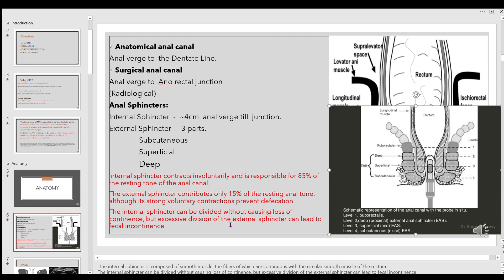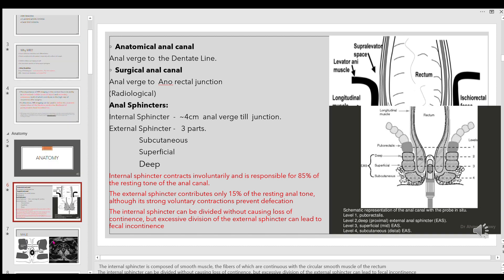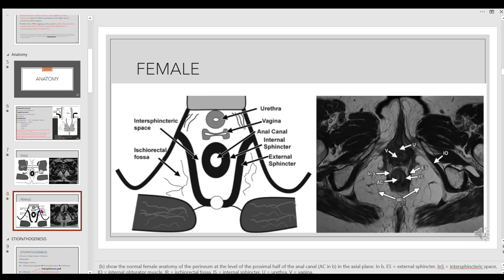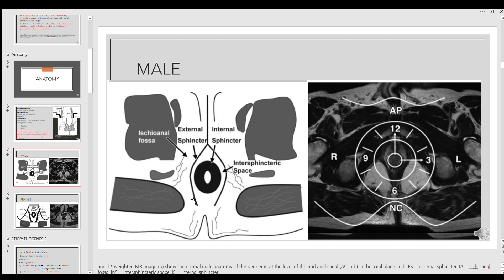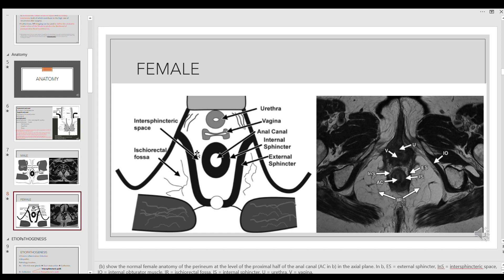You should clearly mention in your report which sphincters are affected. In the male pelvis, the external sphincter merges anteriorly as a closed structure. In the female pelvis, the external sphincter tends to laterally deviate, almost touching the pubic bones, to accommodate the urethra and vagina. As a result, more complex inter-sphincteric tract fistulas are commonly seen in females.